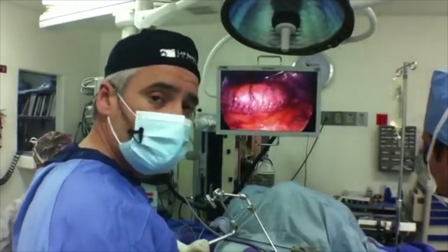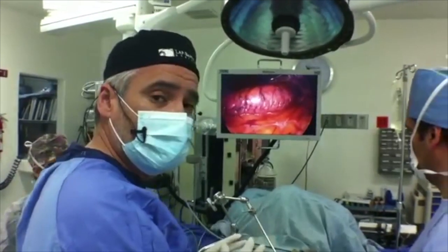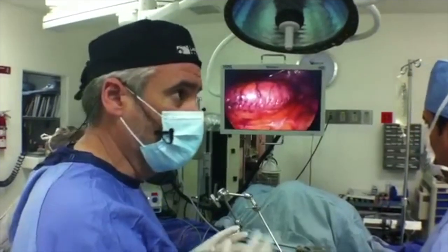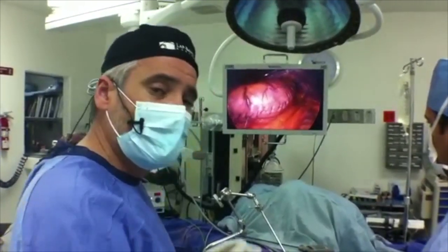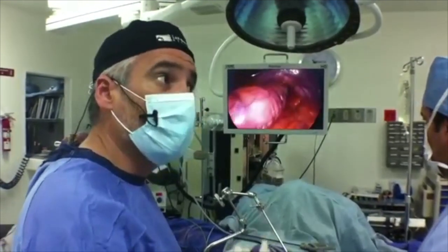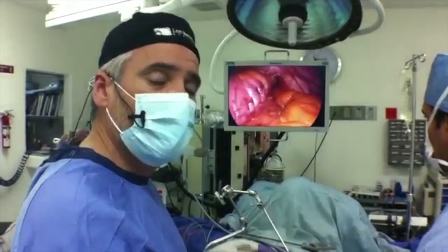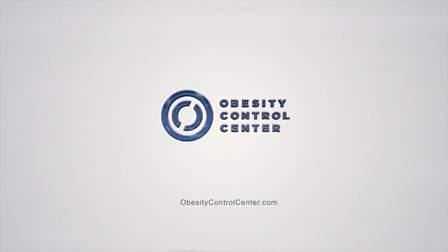This second containing line of stitches is very symmetrical, causing no ischemia whatsoever. This combination of stitches and this technique is what keeps the patient complication-free. We have not experienced any of these complications, and we know for a fact that herniations that happened in other cases were resulting from a different combination of stitches — not a single chain of stitches.